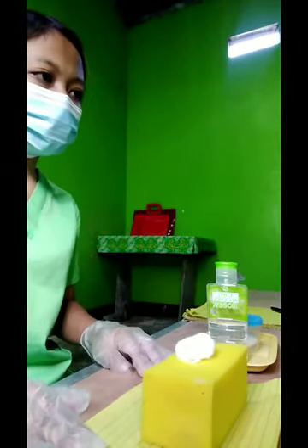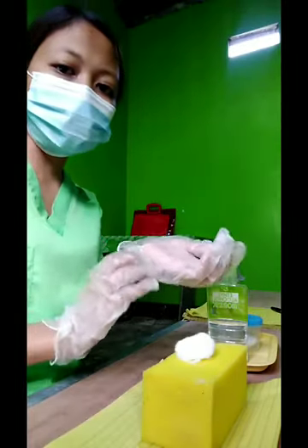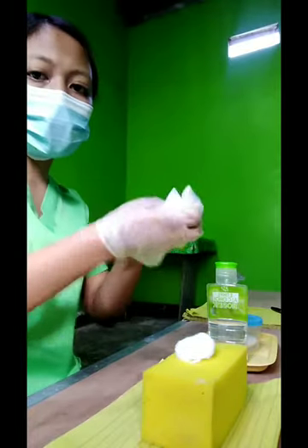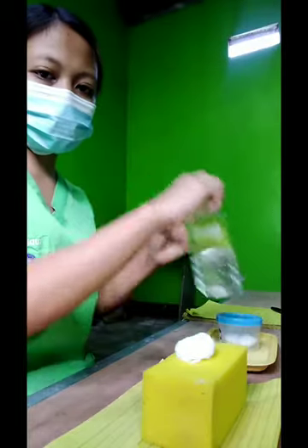Then, assist the patient to a position of comfort. Remove gloves and dispose of them properly. Then perform hand hygiene.